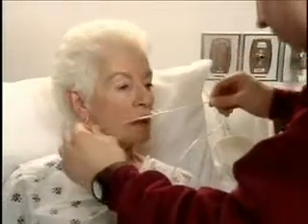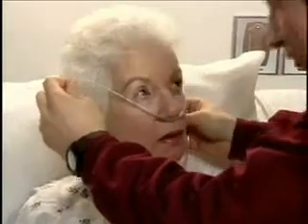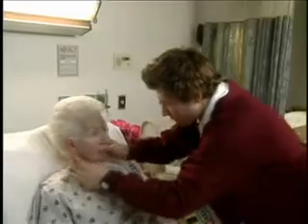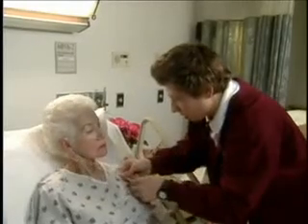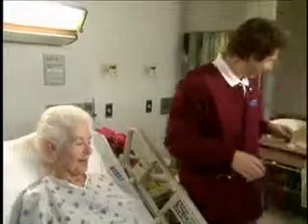Now, if the prongs are curved, the curve should follow the angle of the nose with the points down as they enter the nostrils. Okay, now I'm just going to loop the tubing around your ears. Okay? How's that? Just fabulous. I feel like a real patient now.